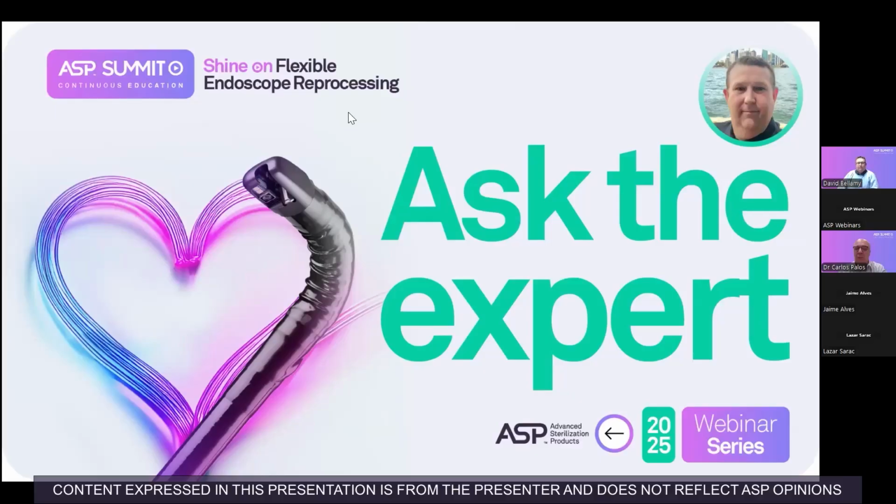And sometimes, as experience has shown us, we have from time to time problems, outbreaks related with the use of endoscopes, not only duodenoscopes, which are of course the most important in terms of risk, but also other endoscopes. You should all take a look at the references in order to complement your talk, because we could be here for the entire day talking on this with your enthusiasm.